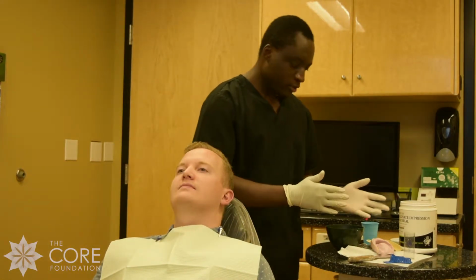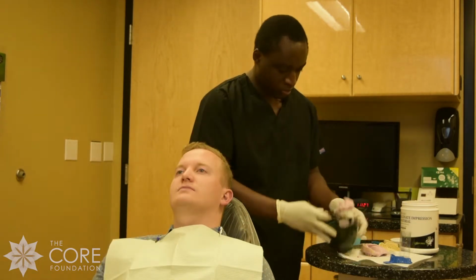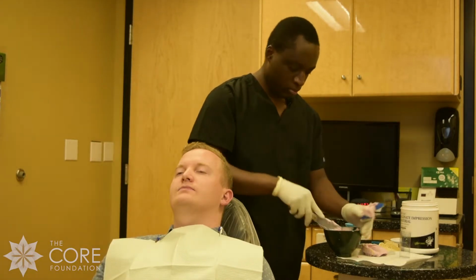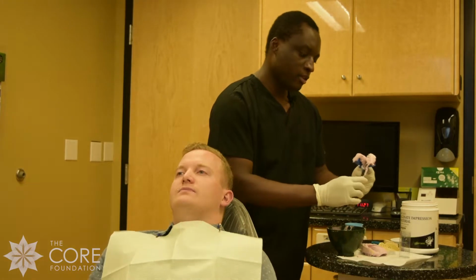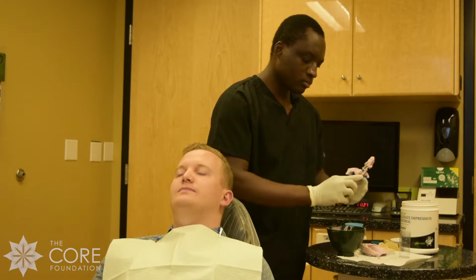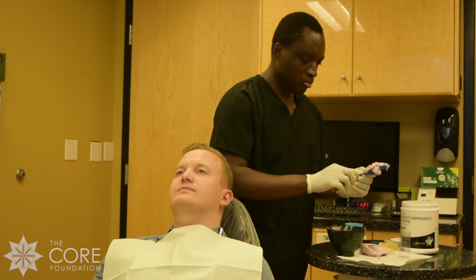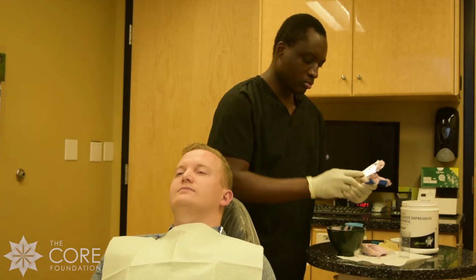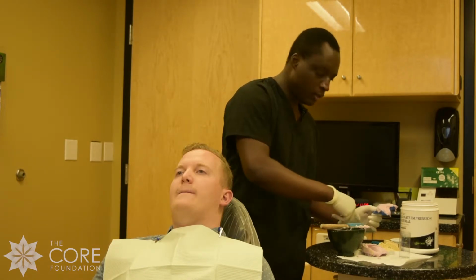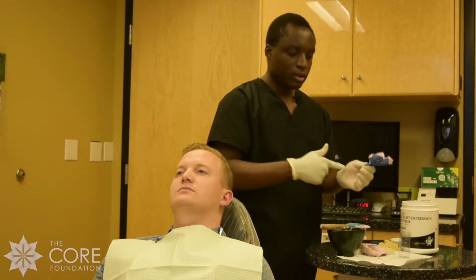Okay, I have everything also cleaned out here. We're going to get ready to take the lower. I am filling the impression tray really well. And for the lower, you just dip your hands in the water, kind of go around it to make a real smooth edge for the teeth.